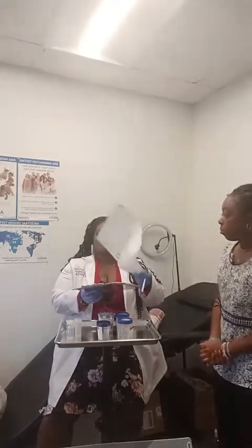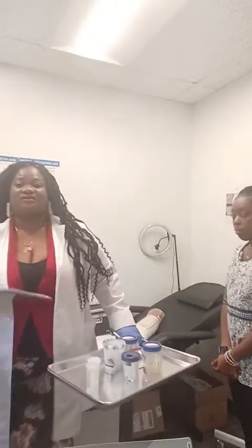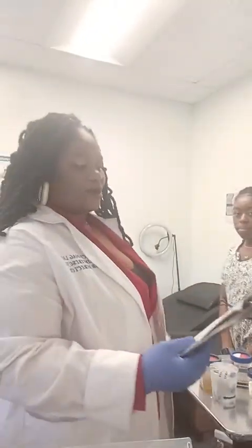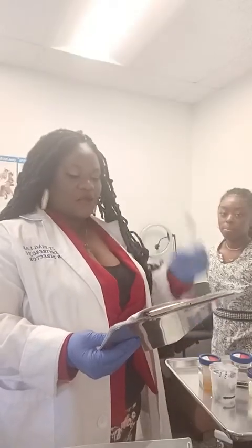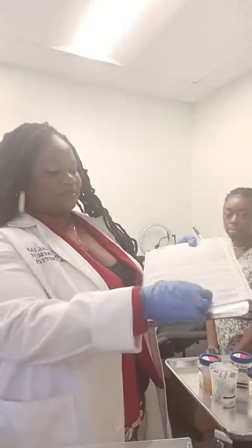So once that is completed, I am the collector. I'm going to go back, flip it over, and do step 4. My information simply is asking for my name, my signature, and today's date, the date of collection. All right. And also the delivery services. I am releasing this bottle to FedEx. Go ahead and do that.